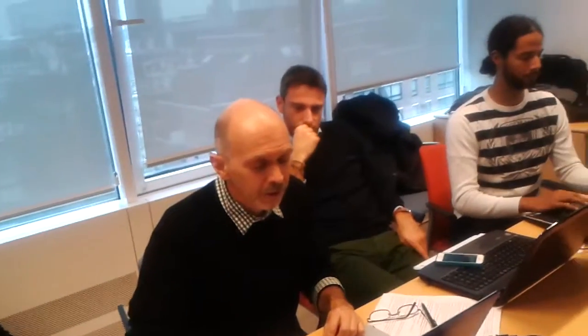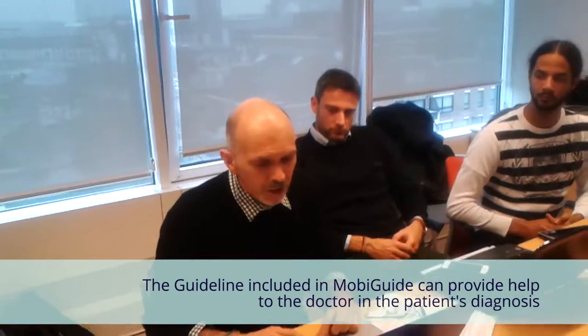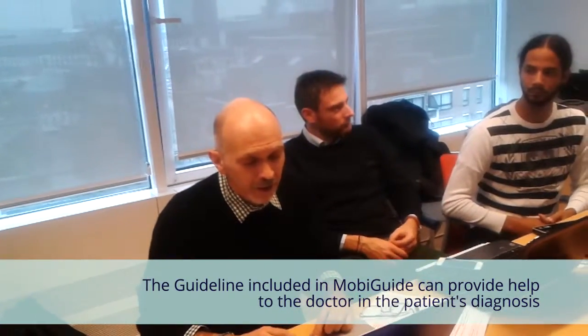At this point, we have to have the patient into the hospital because we need to activate and take a decision based on this new diagnosis that has been done using the MobiGuide system. Because we have a switch from one diagnosis to the other, so of course the treatment changes. We talk with the patient and we decided to go with electrical cardioversion. And so we start a visit using guideline assistance.